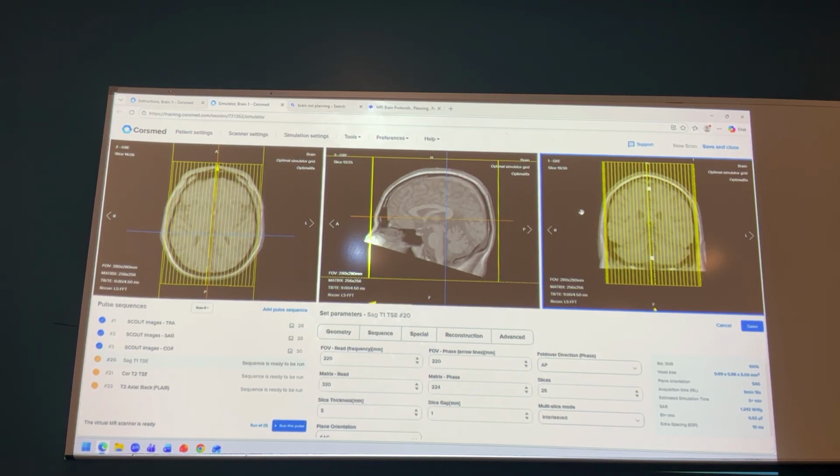And the axial, how do you cut for axial? This is axial. So the way it goes is top to bottom, or superior to inferior. Okay? And then for coronal, any ideas how you cut? So it's anterior to posterior, or front to back?